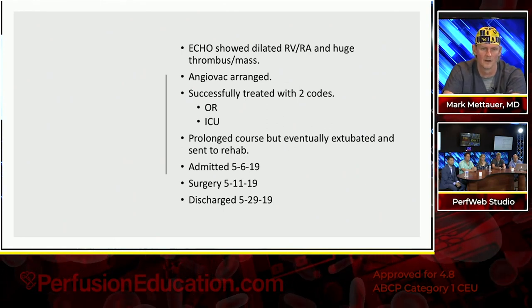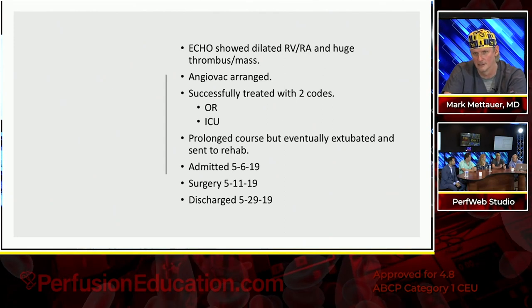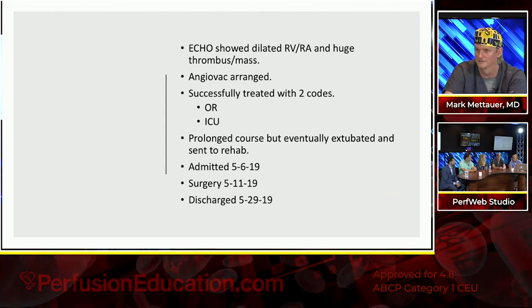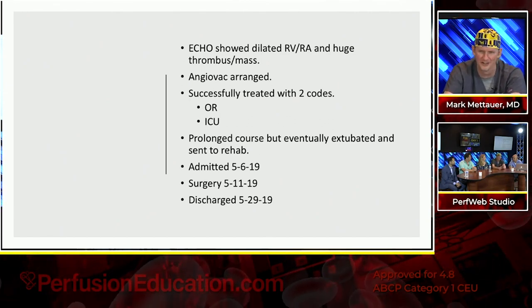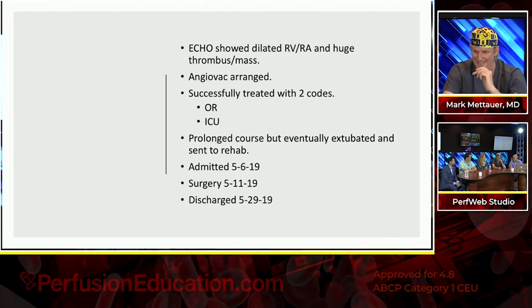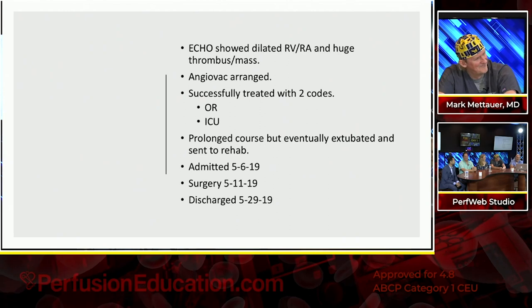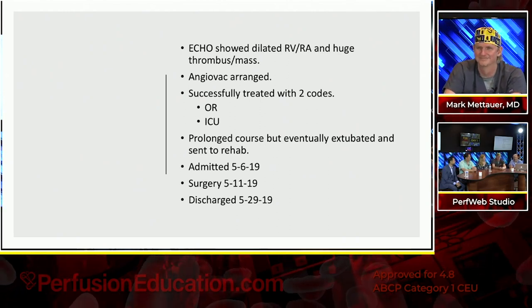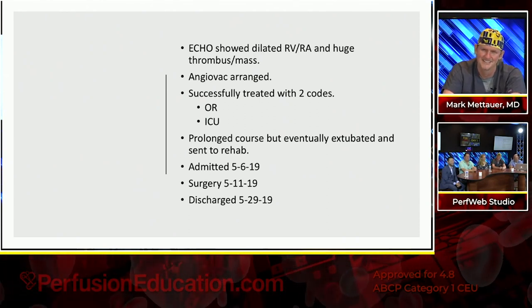This was the one where we actually turned it on low flow, did not open the pedals to the AngioVac, and Joe started getting a little nervous because we had absolutely no flow to even start with. And I accused him of having the pump backwards. Not that he's done that before. I think we have an edited video of that. Right, without the four-letter words. Yes, which they can enjoy.